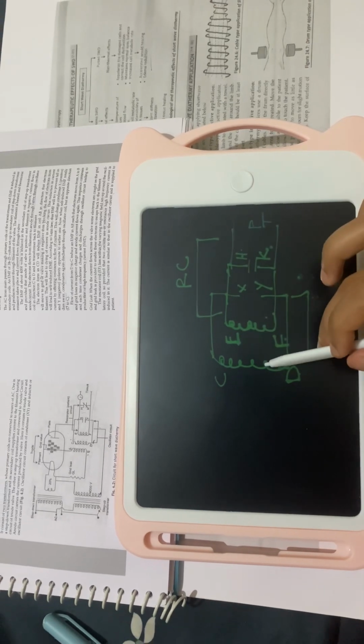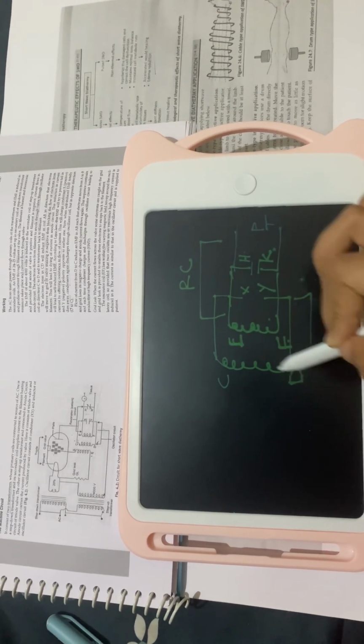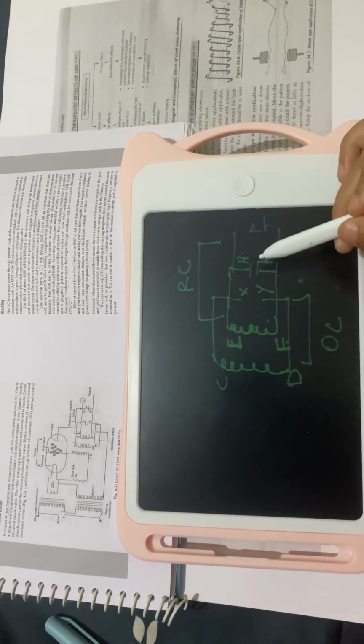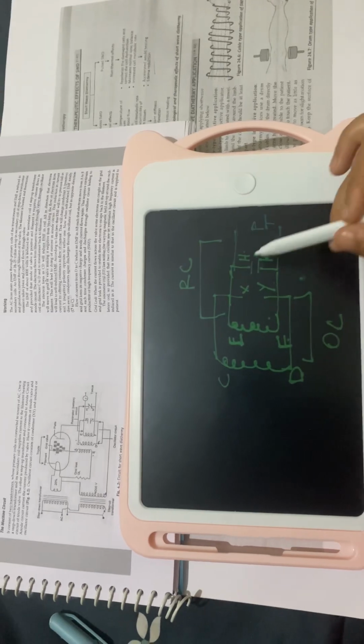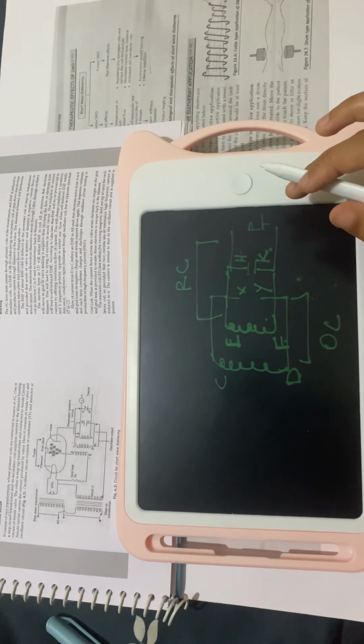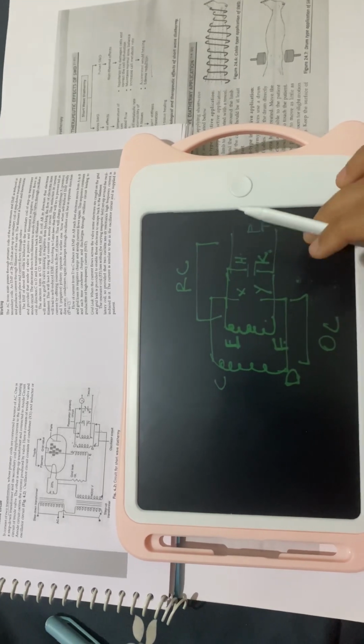Close to the inductor coil, there is an oscillating coil CD, which is the inductor with a condenser XY. This is the oscillator coil. This is the resonator coil. So this is the patient circuit.